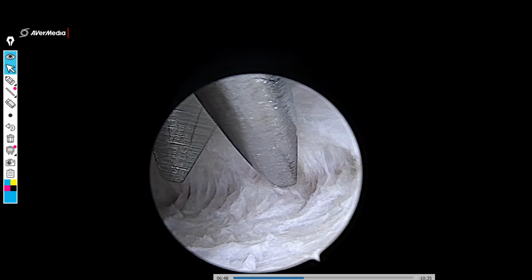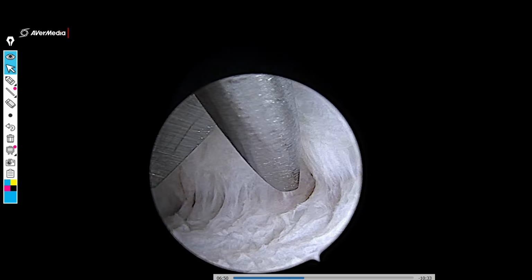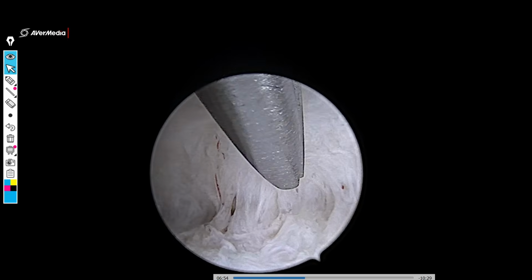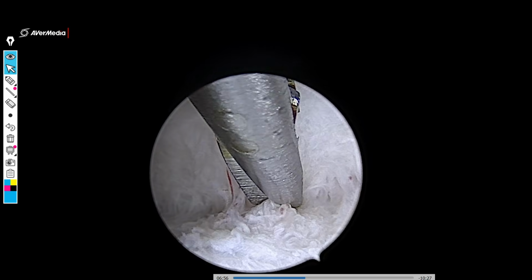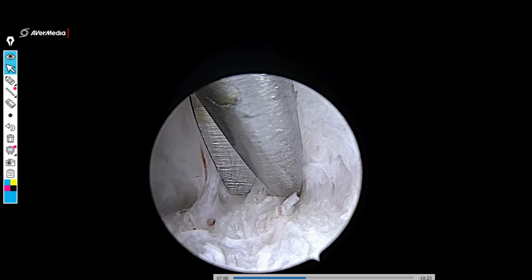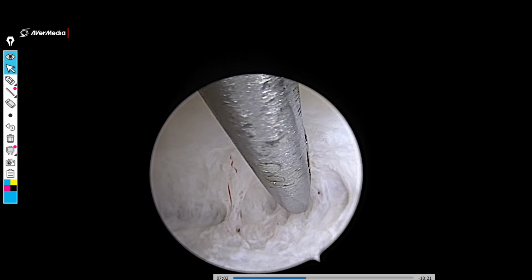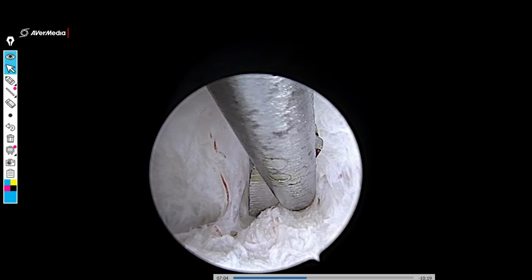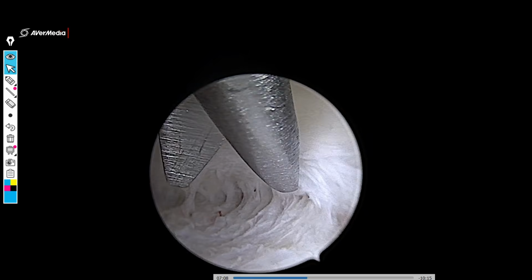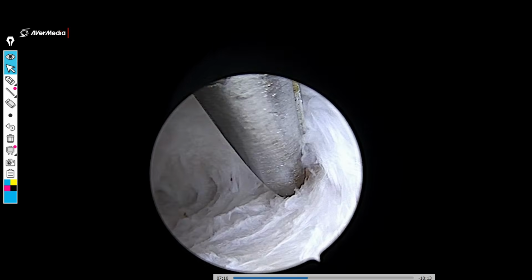Notice that the hysteroscopic scissor, this is a standard Indian hysteroscopic scissors. You do not need to buy very fancy or very expensive equipment to do this. With a standard hysteroscopic scissors, notice that very small snips are being taken. So literally, this is like chiseling or sculpting the endometrial cavity millimeter by millimeter into its original shape.